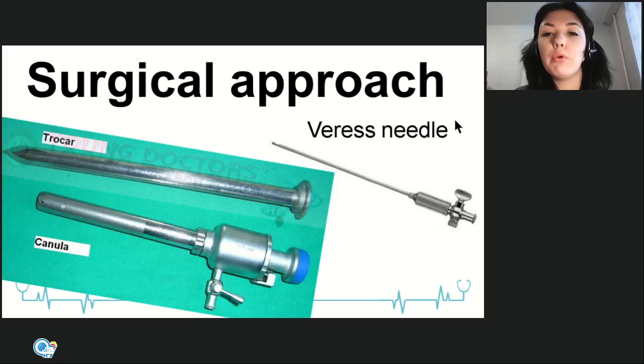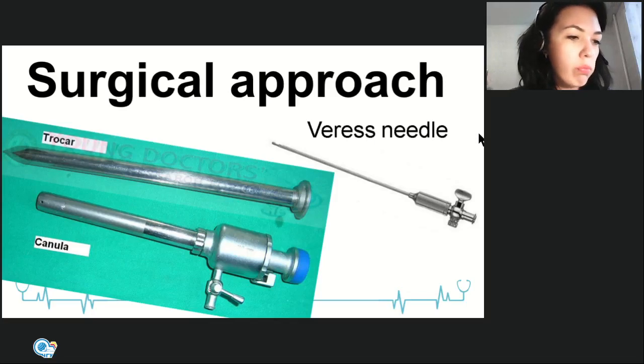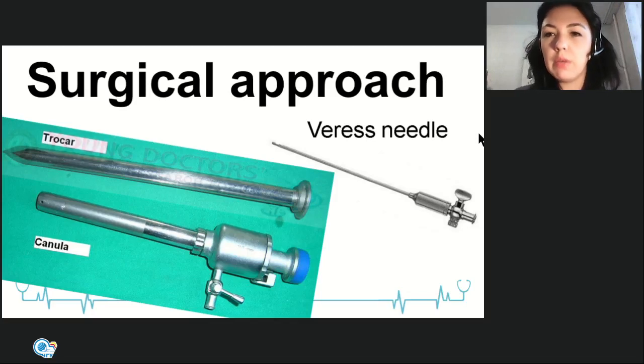So first of all, surgical approach is different. I'm talking about laparoscopy because it's more habitual for me, I'm used to it, but what I say about laparoscopy is the same we can say about thoracoscopy and all the other minimally invasive surgeries. In case of open surgeries, for surgical approach we use instruments which we saw at our surgical museum. Yes, those are the scalpel, scissors, maybe some other instruments for the dissections.